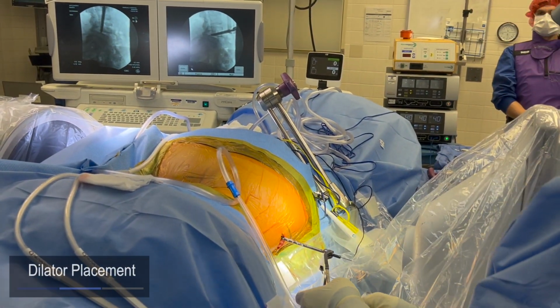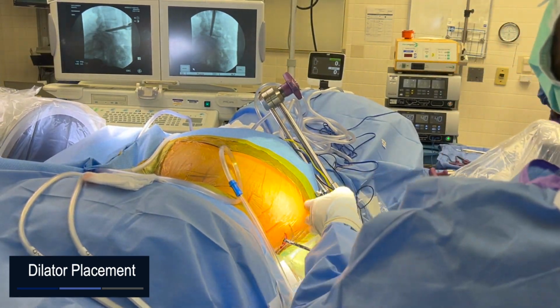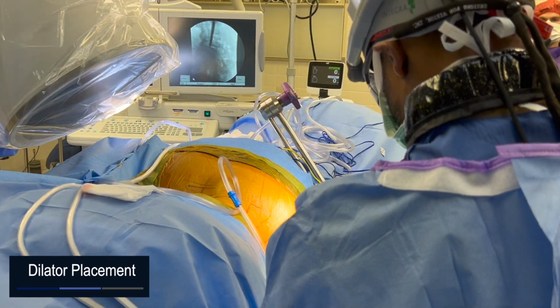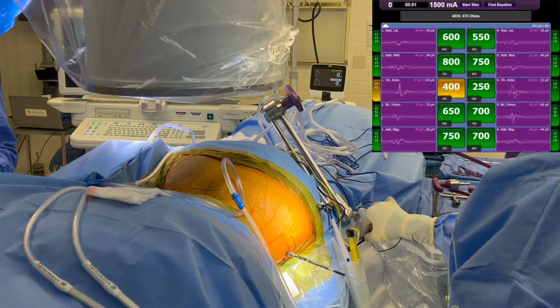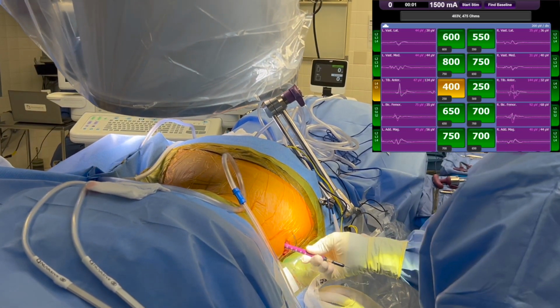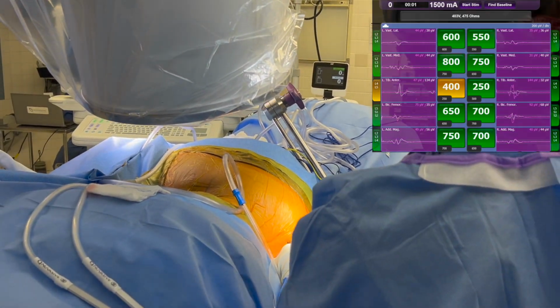All right, save that left to right. Come up to an AP and then mag it this time. Run a TMAP. Okay, running TMAP. Okay. Let's see the other dilator. Change less than 400. All right. What is the change? Same thing? Same as the last run. All right.